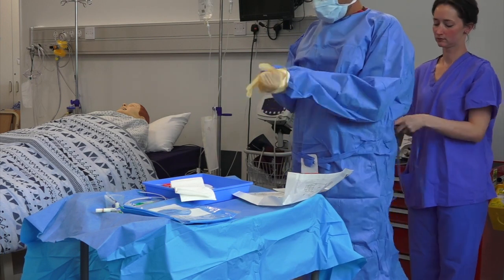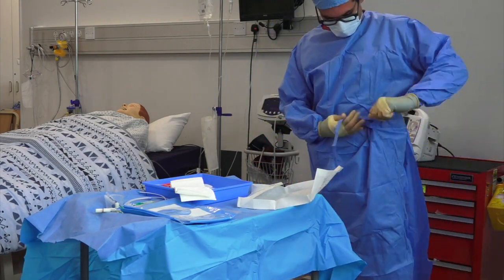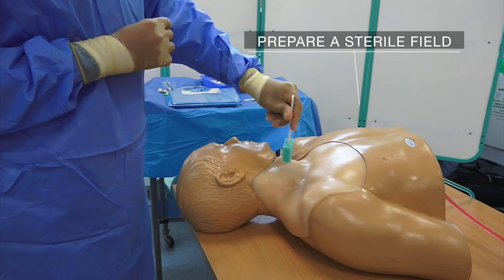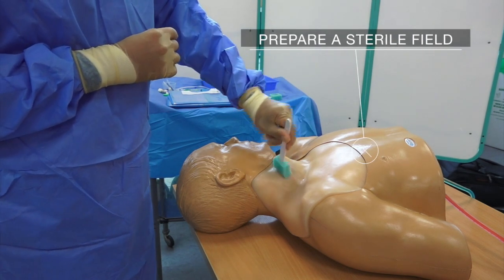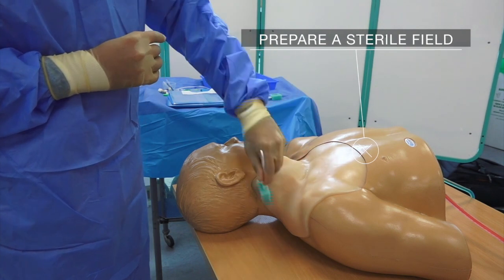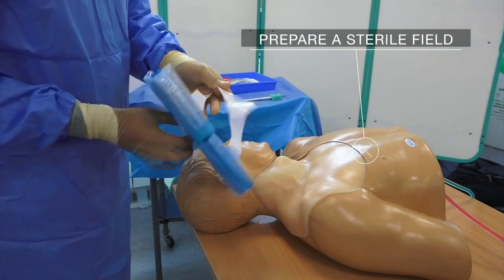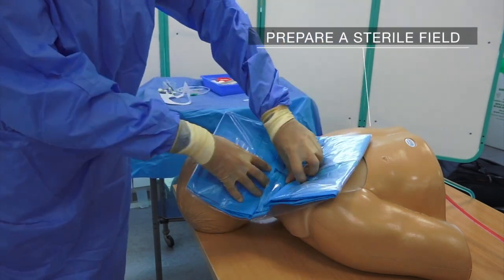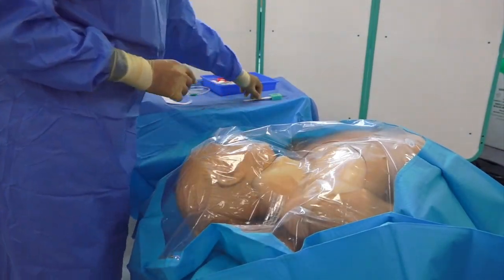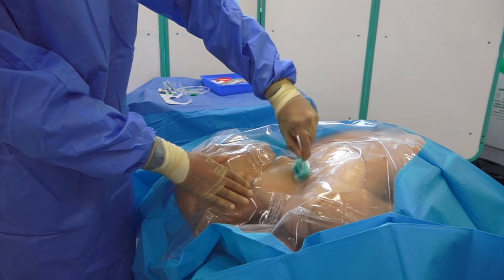Have an assistant to help you tie your gown and put on sterile gloves aseptically. Position yourself at the head of the bed. Prepare a sterile field starting by sterilizing the neck with chlorhexidine swabs rubbing in a rotational outwards pattern. Apply a sterile drape to the neck, making sure not to lose orientation of the drape. Repeat the process of sterilization with a chlorhexidine swab.